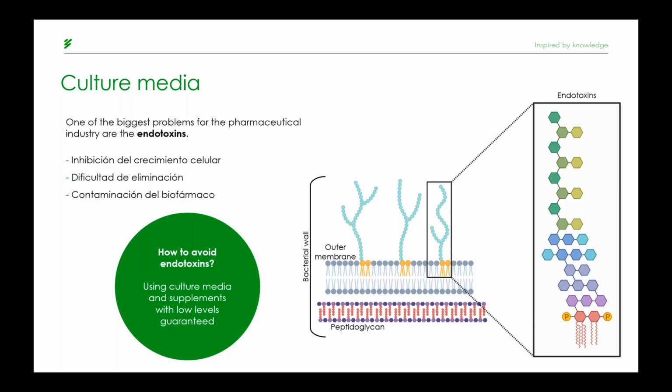Trying to eliminate these endotoxins after the bioprocess, after the purification, means the destruction of the product. So the best way to avoid the introduction of these endotoxins in the bioprocess is to use media and supplements with the lowest possible concentration guaranteed.